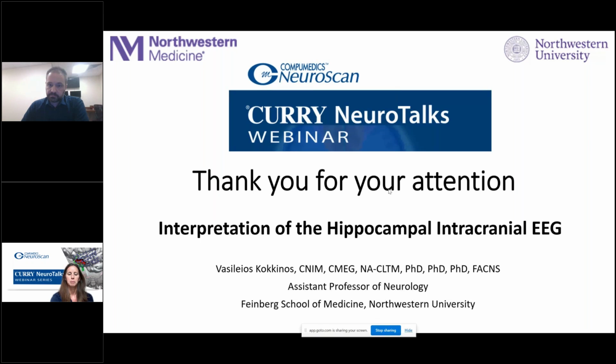Yes, we have a question from Shruti A. Could you comment on differences in ictal patterns of seizures from the hippocampus?